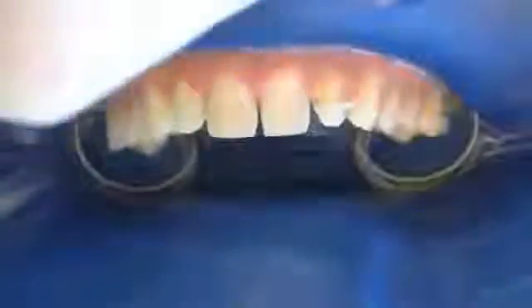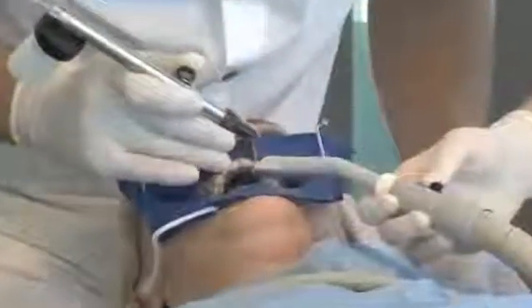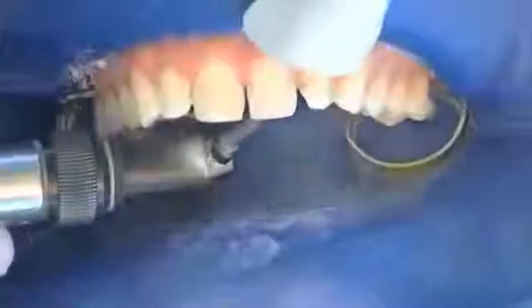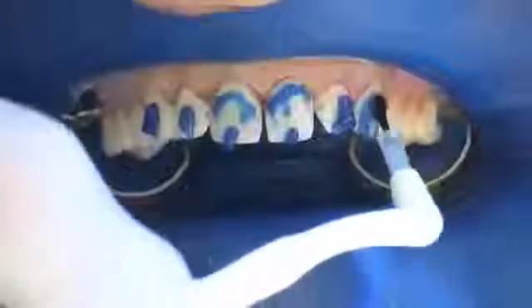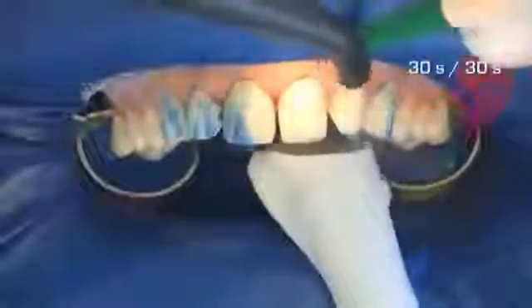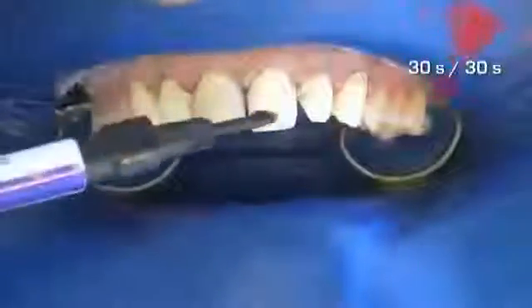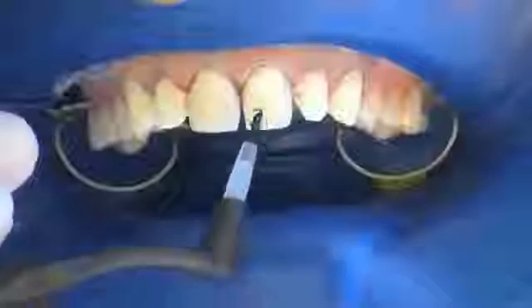The teeth are cleaned after removal of the COMPONEERs and preferably sandblasted to ensure subsequent optimum conditioning. A retraction cord can optionally be placed for improved cervical control. The etching gel is applied to the teeth and distributed to all surfaces by using a brush. After 30 seconds, the gel is thoroughly sprayed off for 30 seconds and air dried.